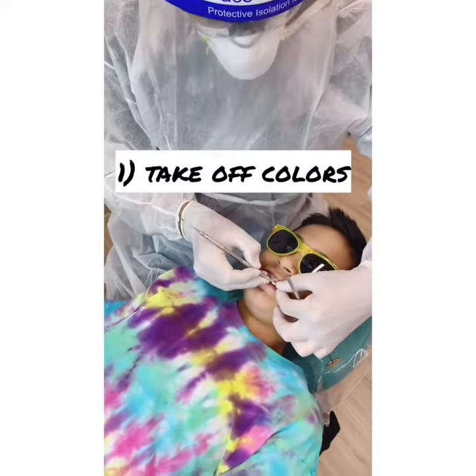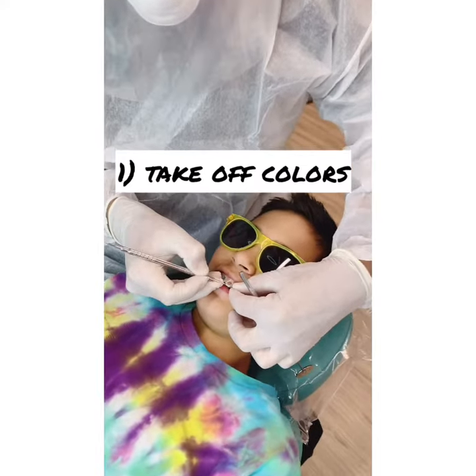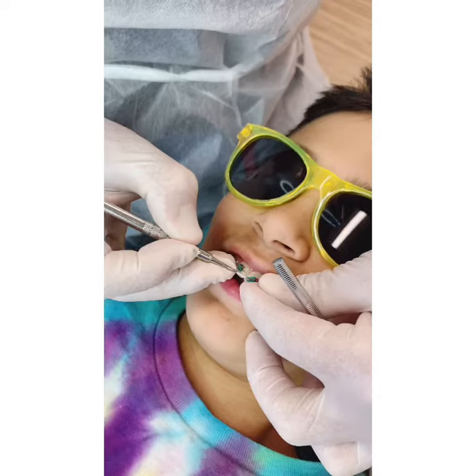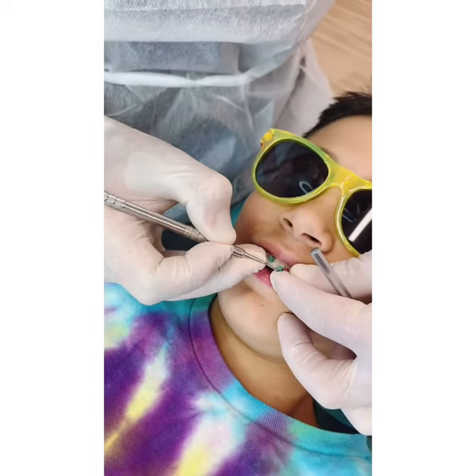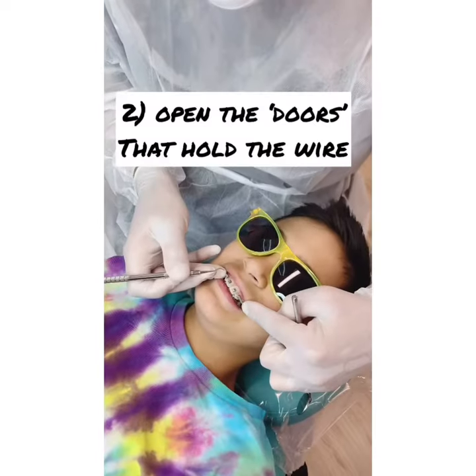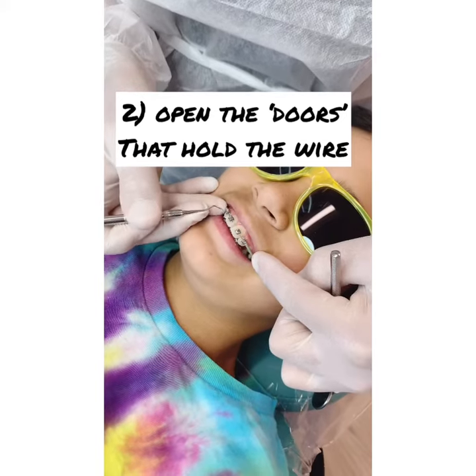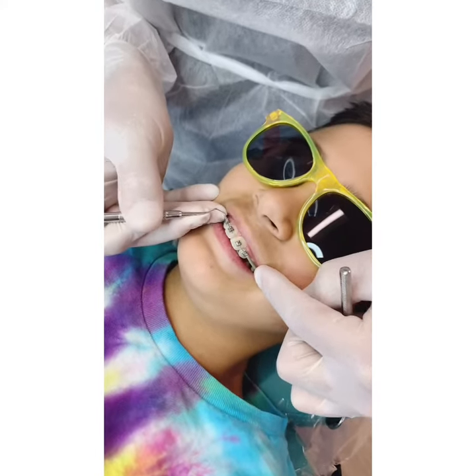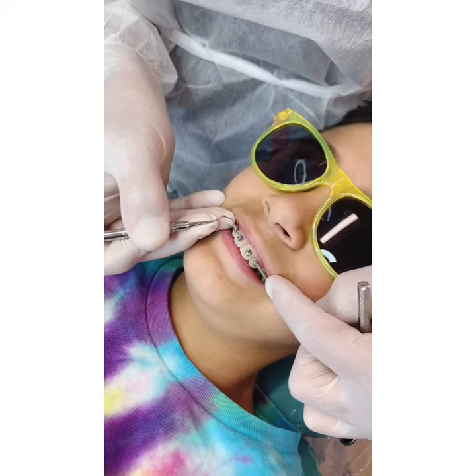First off we're going to take off the colors that decorate the braces. The type of bracket I use is a self-ligating bracket, which means it has a door that holds the wire into place. The colors on the braces are just used for decoration.